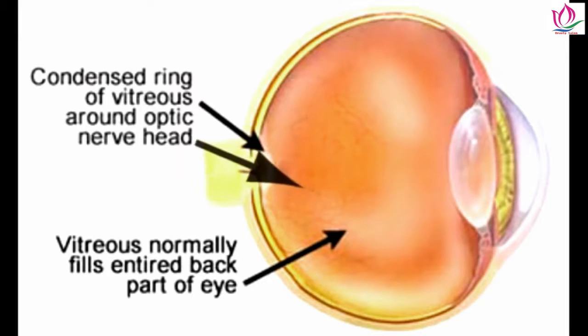collagen admixture. Behind that is a particular density of collagen, which corresponds to the optic nerve head as it enters into the eye. Normally, this is not seen unless it were to separate and hover or suspend itself in front of the retina, where it will cast a shadow.